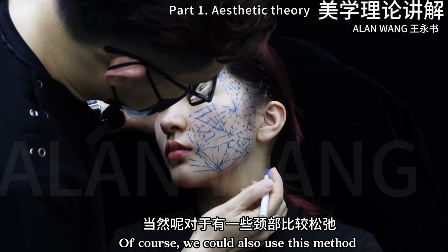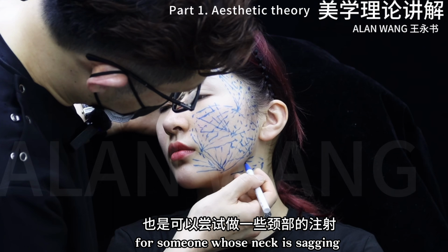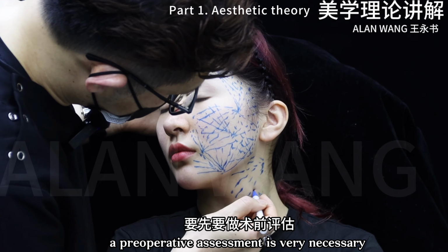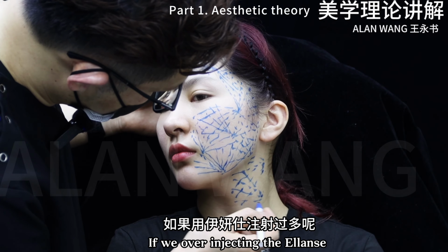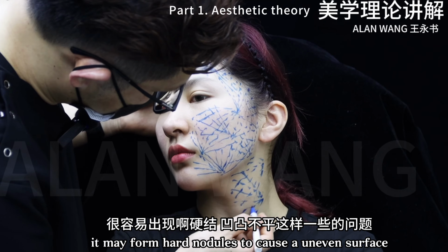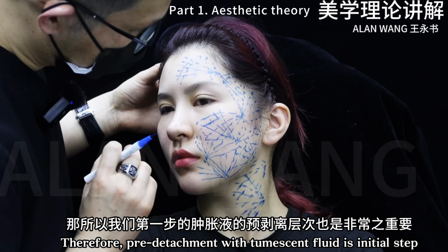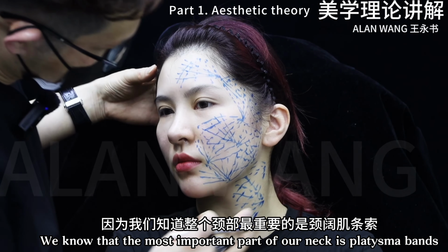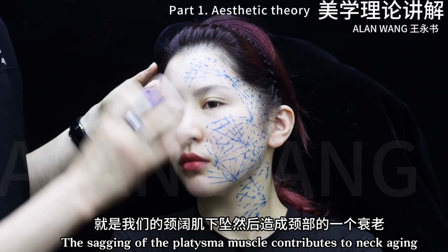Of course, we could also use this method for someone whose neck is sagging, but please remember, a preoperative assessment is very necessary because we all know the tissue of the neck is very thin. If we over-inject the Ellansé, it may form hard nodules and cause an uneven surface. Therefore, pre-detachment with tumescent fluid is the initial step. We know that the most important part of our neck is the platysma bands. The sagging of the platysma muscle contributes to neck aging.